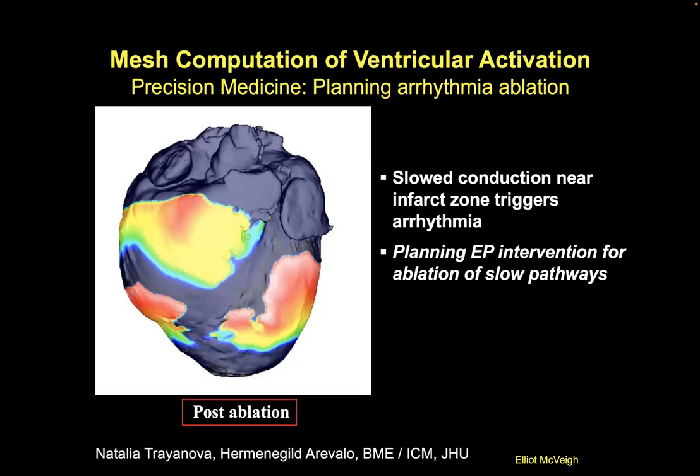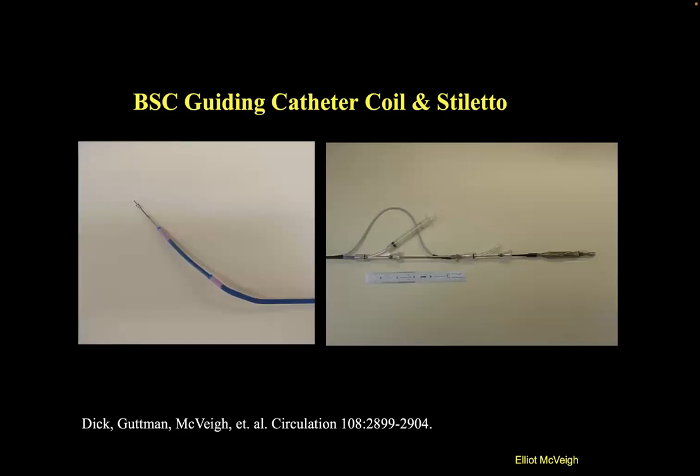You have to be careful, obviously, because if you make ancillary burns and things like that, it would exacerbate the problem. So you want to make sure that you have your burns in the right spot, right? To try and clean this up and ideally probably make it an ellipsoid of dead tissue, right? So that this stuff can go around it without going through it. So that was the theory of that intervention, or using MR late gadolinium enhancement for that intervention.